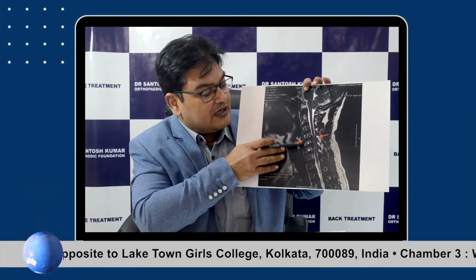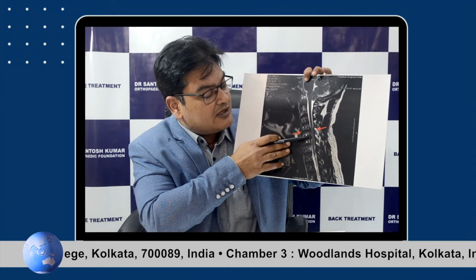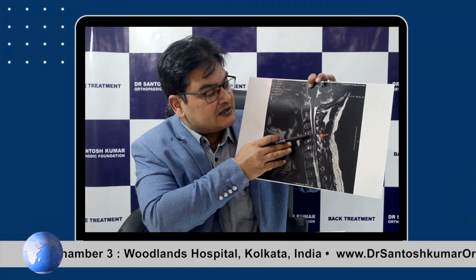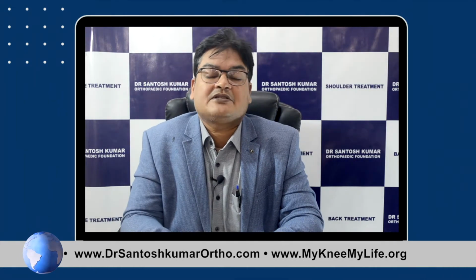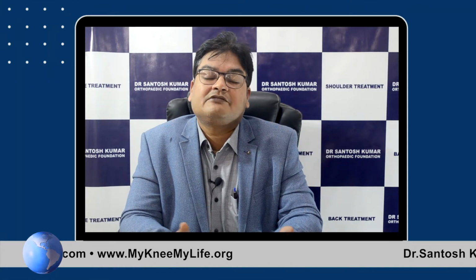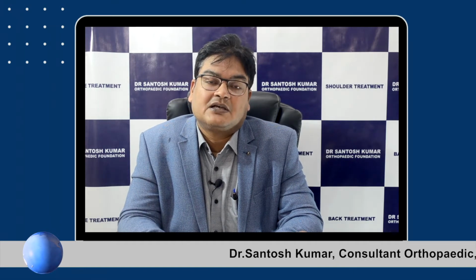This is an example of an MRI where there are multiple level disc prolapses. There is a disc prolapse between C5, C6, there is a disc prolapse in C3, C4. So multiple level disc prolapses are there, and all these things can be made out in MRI. Now, as I told you, more than 95% of times it can be managed just with medicines. We have to give some time, and most of the times people get well with time and medicines. But if it is not happening, then we have to do surgery, or if there are conditions like neurodeficit when weakness has appeared, in that case we have to do surgery.